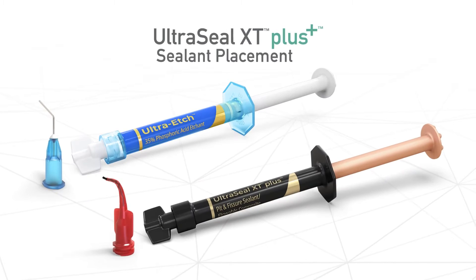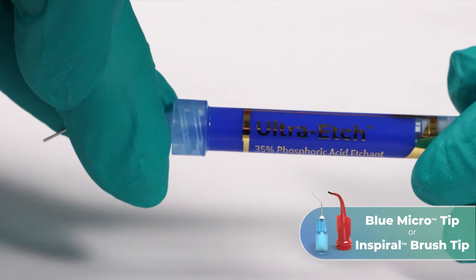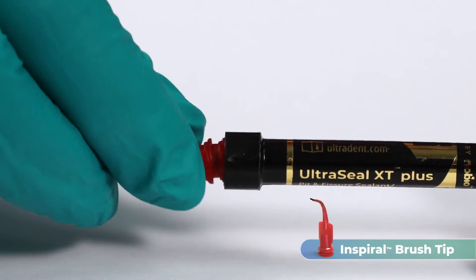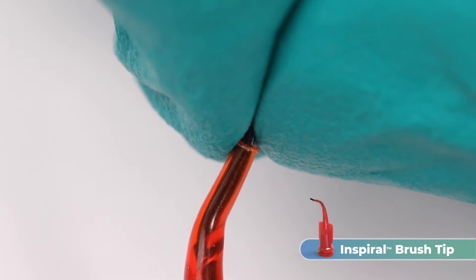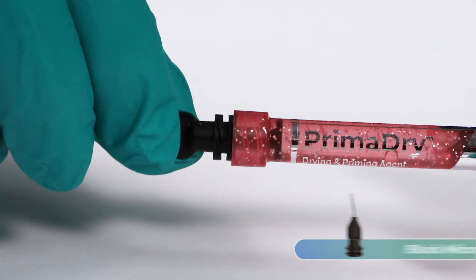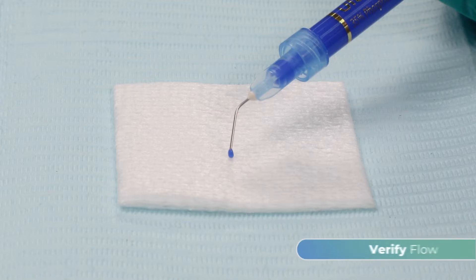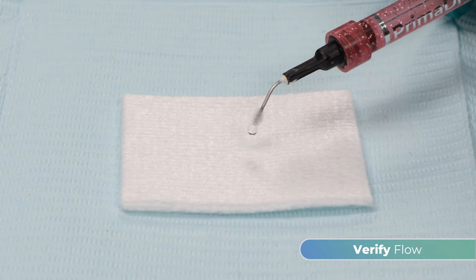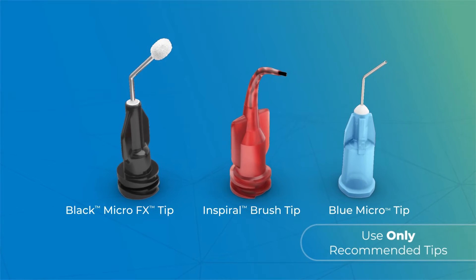To prepare UltraSeal XT Plus Sealant for placement, attach an Inspiral brush tip or a blue micro tip to an Ultra-Etch 35% etchant syringe. Attach an Inspiral brush tip to an UltraSeal XT Plus Sealant syringe. If needed, adjust the bristle length by grasping them and moving them in or out. Attach a black micro FX tip to a PrimaDry drying agent syringe. Next, verify the flow of all syringes before applying intraorally. If resistance is met, replace the tip then recheck. Be sure to only use recommended tips.